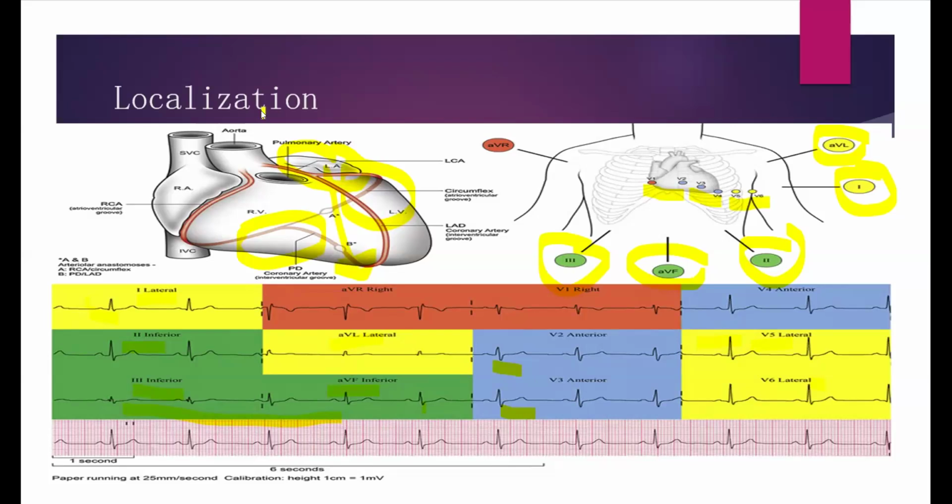So it means that if you get a female patient who already has an ST elevation of above 1.5 in V1, V2, it's not normal. That patient has an MI, even if she's 30 years old, as long as she has signs and symptoms of ACS and she has 1.5, that means a small box and a half in V1, V2, V3.